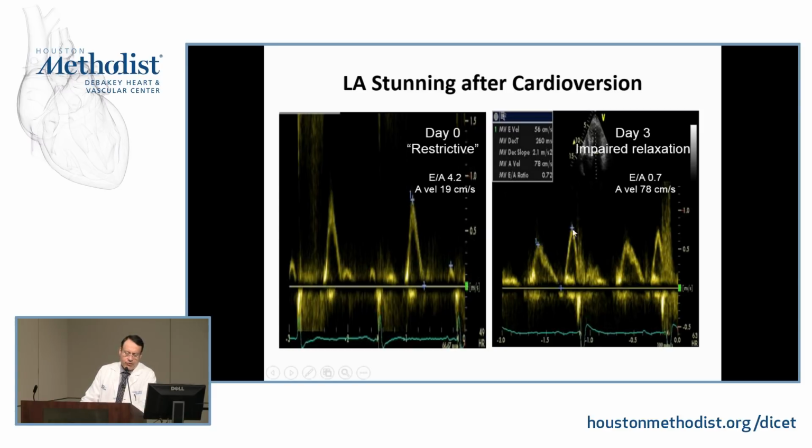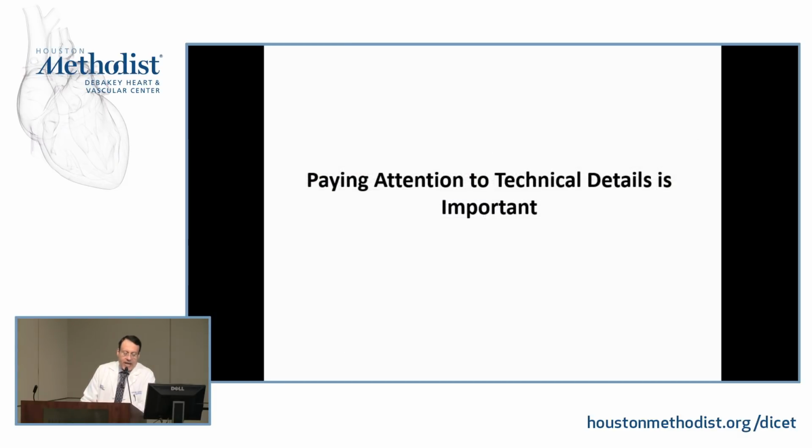Notice what happens after atrial function recovers 3 days later. The peak A velocity is now 78 centimeters per second, and as a velocity and as a contribution to LV filling it is much higher than what it was before. Paying attention to technical details is important. So we said clinical is one piece of it. I just gave one example. There are many others. Paying attention to technical details is important, both on the side of the sonographers as they are acquiring the signal and on the side of physicians when they are going through these signals. Just because you have something presented to you does not mean you have to use it.